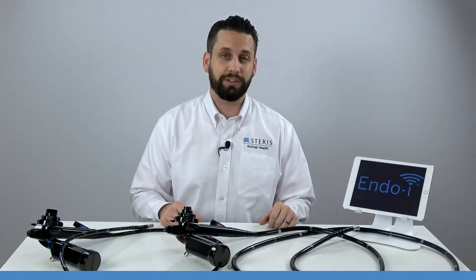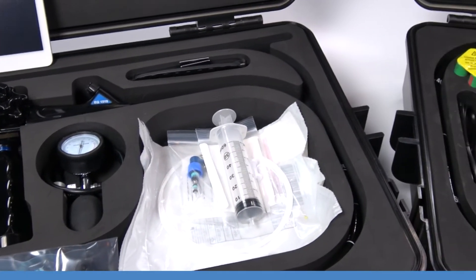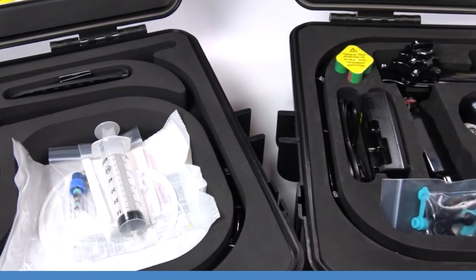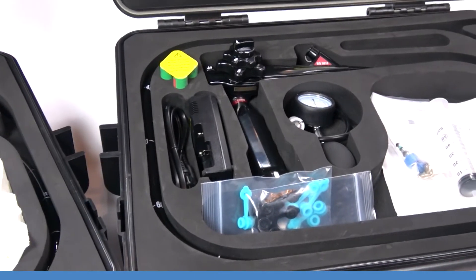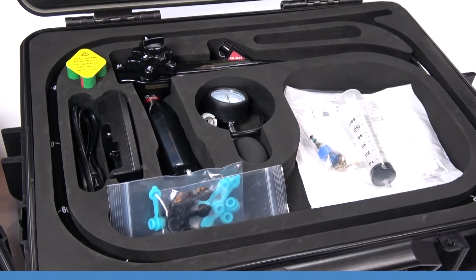Hi, I'm Lucas with Steris Animal Health and I'm excited to share with you our EndoEye veterinary endoscopes. Currently we have two models of our wireless scopes available on the market. The EndoEye EQ1510 is a one and a half meter scope ideal for large animal airway examinations, and our three meter EQ3013 is intended for inspection and treatment within the upper digestive tract of horses.